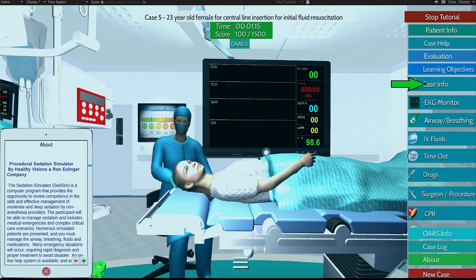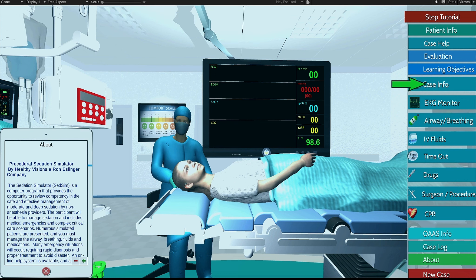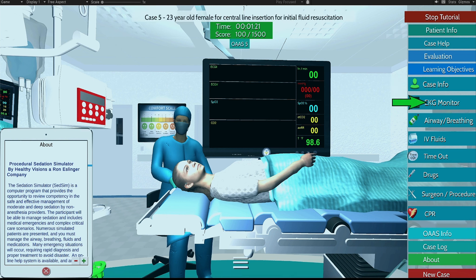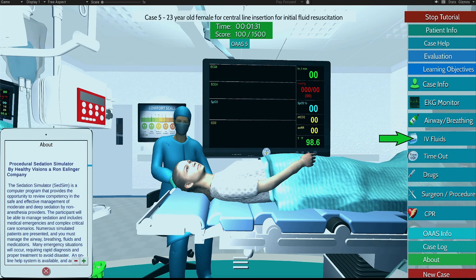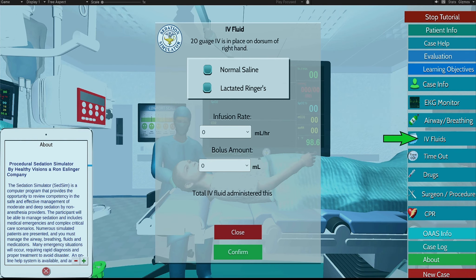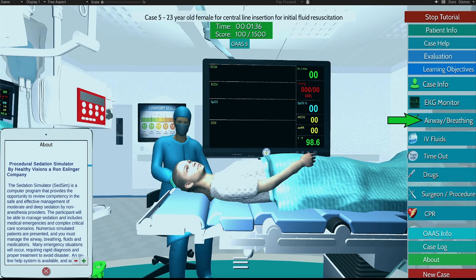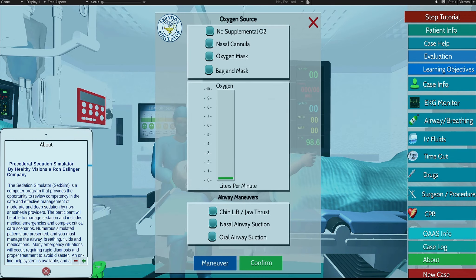Press here when you are ready to start or continue your patient's case. This icon is your case info menu — the form we were just reviewing. Please access frequently for patient updates during the procedure. This icon is where you connect the monitor leads for vitals. This icon is used to administer IV fluids. This icon is used to administer oxygen and perform airway maneuvers.